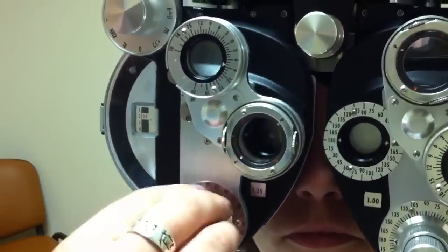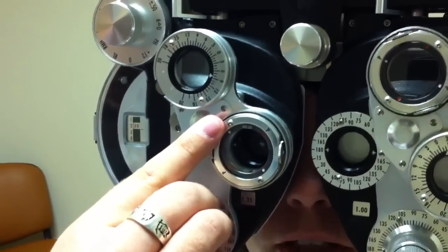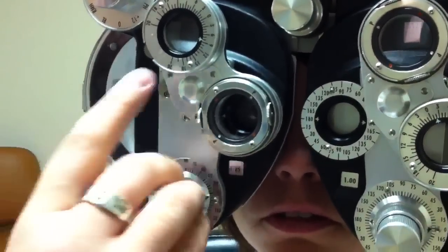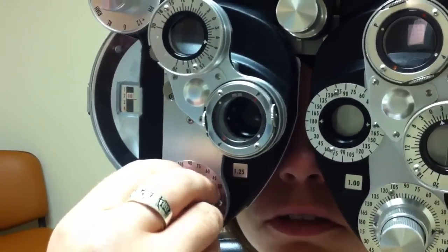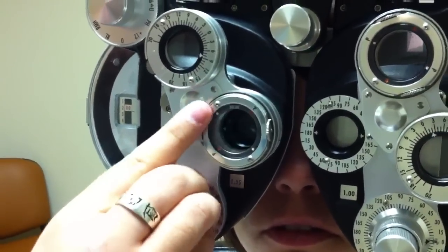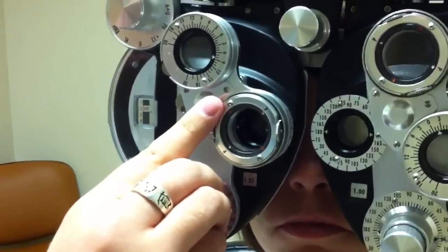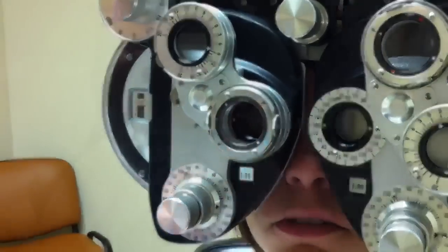So we're doing plus, so I ask her which is better — one or two? One. She likes one better. Notice the white is on this side of the knob, so I turn it this way — I'll probably go about 10 degrees. One or two? Two. She likes two again, so I'm going to get closer to that 180 about halfway through. One or two? Two. She likes two again, probably back at 180.